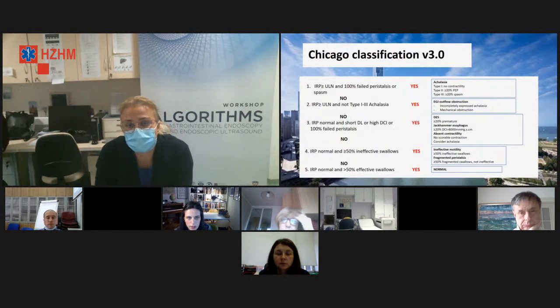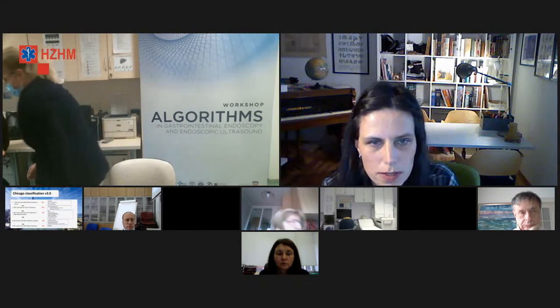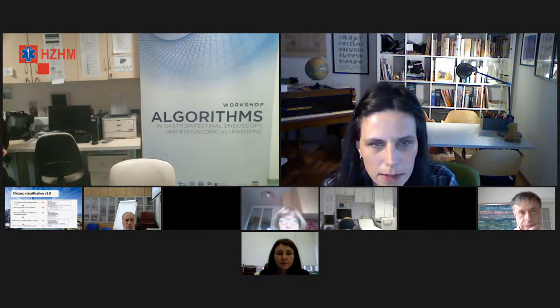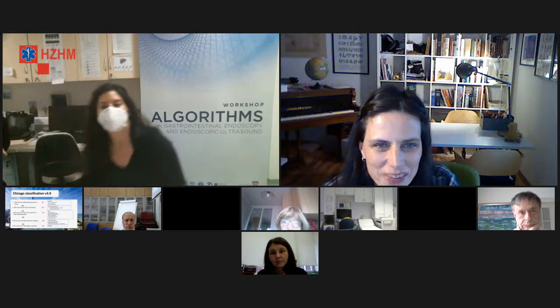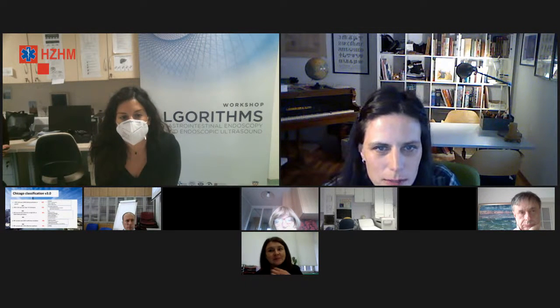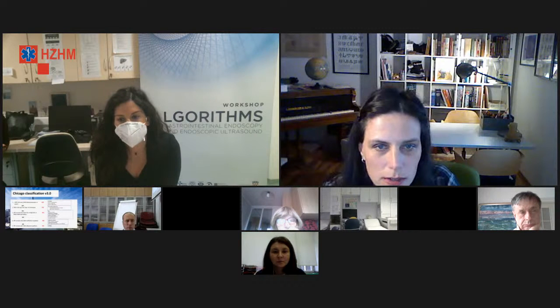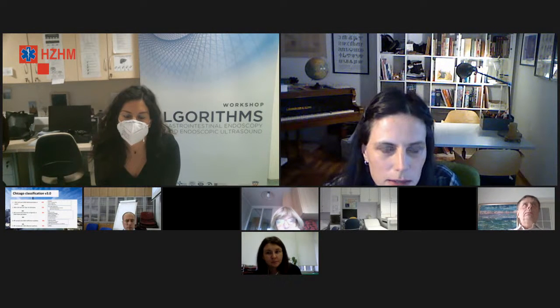Evo, hvala Jelena. Možda bi sad prvo započela s doktoricom Močić, evo s istim pitanjem kao kod pH-metrije. Ana, indikacije za manometriju kod djece, od koje dobi možemo? Moja znanja od prije su da se manometrija jednjaka ovim kateterom kojeg mi imamo može raditi djeci od 7 godina nadalje. Ispravite me ako je krivo i evo nešto malo edukacije o pedijatriji.